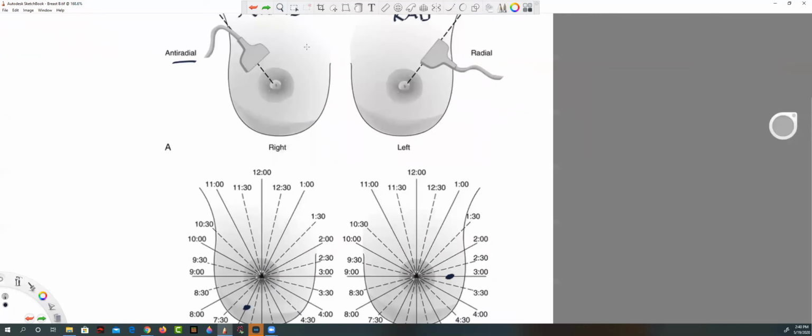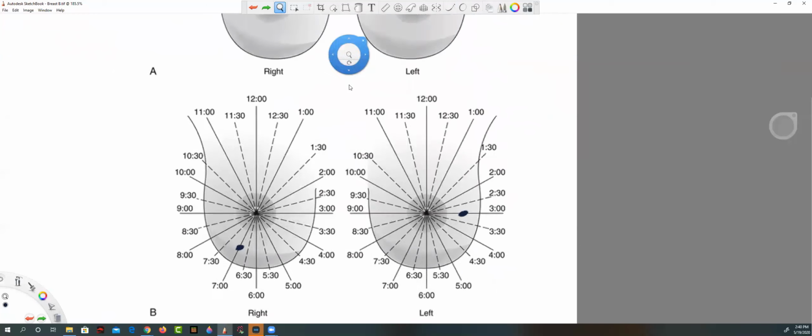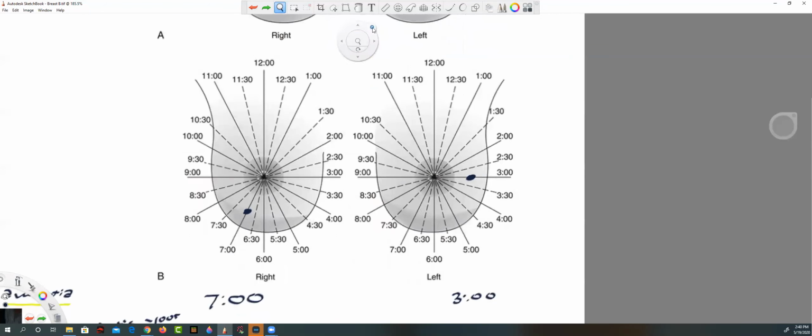And of course, like I said before, if you just want to do, I don't know why it's so hard to draw a straight line. Sagittal transverse, sagittal transverse, sagittal transverse. That's fine too. Whatever your doctor or your counterparts, your partners want is what you do. But I think they'll all agree with the clock face.